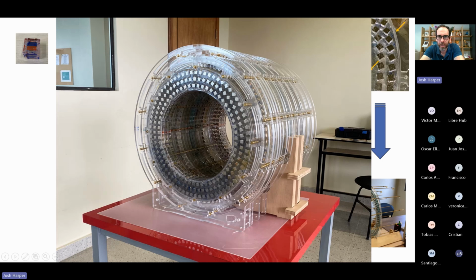So this is a good time if you have undergraduate students or technically inclined people who would like to be involved, but maybe they don't have so much experience. This is a great moment to include those types of individuals in the project and sort of pick out folks who will go on to the next processes and really help with the more technical stuff. So this is our magnet after we put all of the rings together.